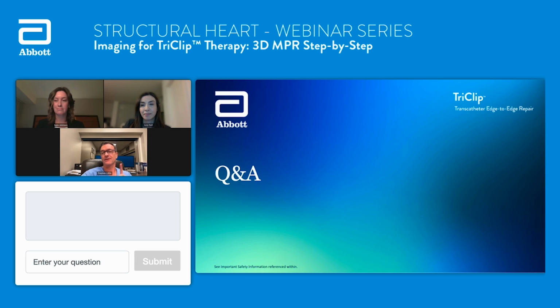And my final addition to this long comment is that the machines are getting better. So the MPR of 3 years ago is not the MPR of today in the modern machines. The temporal resolution is better, the spatial resolution is better, and therefore the utility is better. So if you didn't like MPR 3 years ago, try MPR today. It is different.